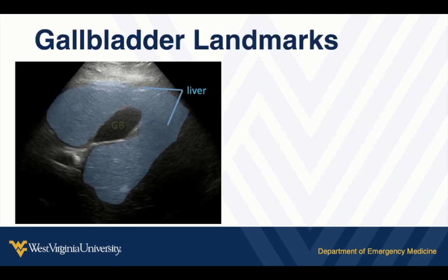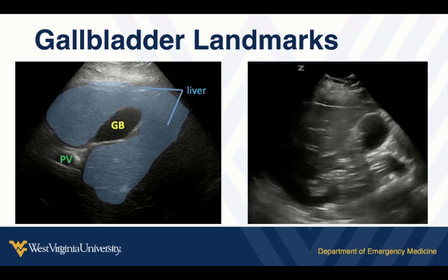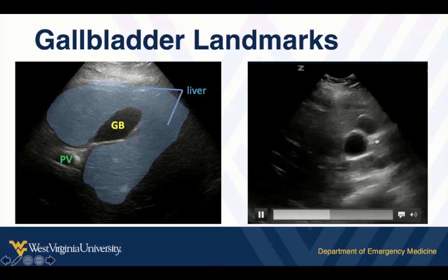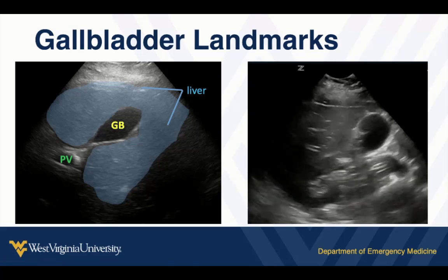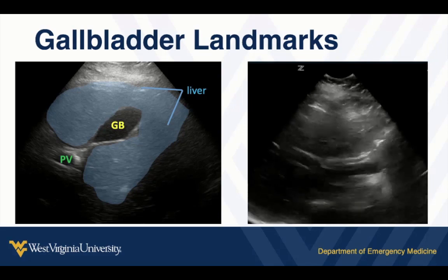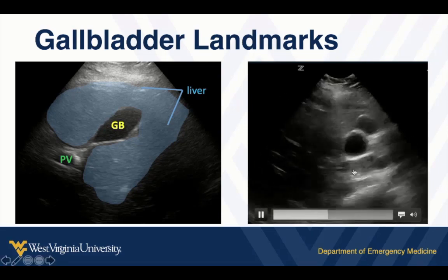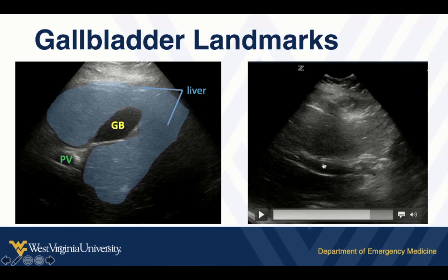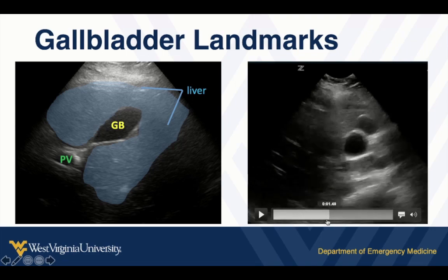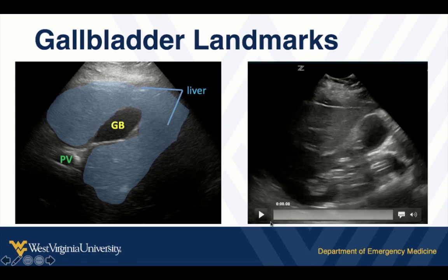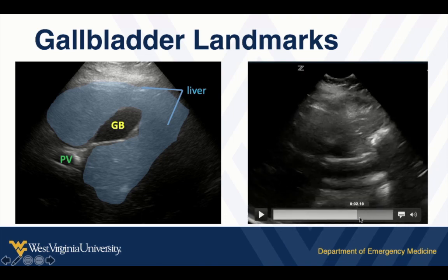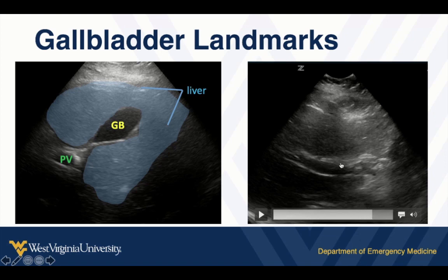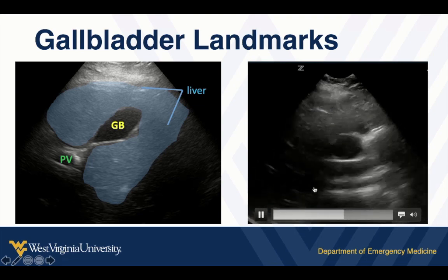Key landmarks: liver, gallbladder, portal vein. In this real-time scan we see the gallbladder — notice it has a fold, so you really want to scan all the way through because you could see a fold and think that's the fundus, but it's not. As we follow down towards the neck, we can see the portal vein. The common duct and hepatic artery run with the portal vein. If we fan through it completely and nothing else is dilated, the common bile duct is normal. Sometimes the kidney peeks in as well.